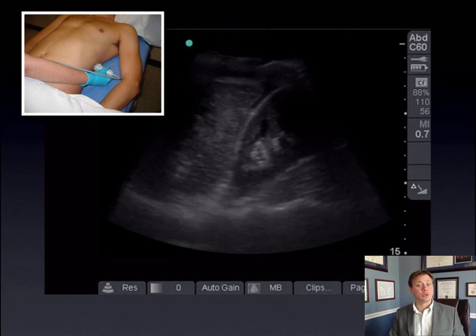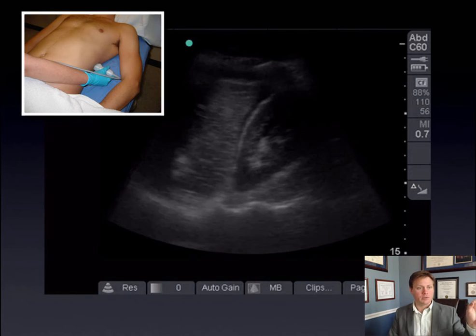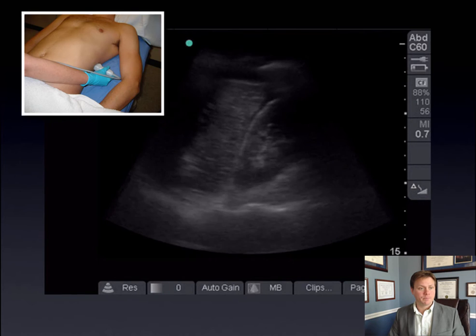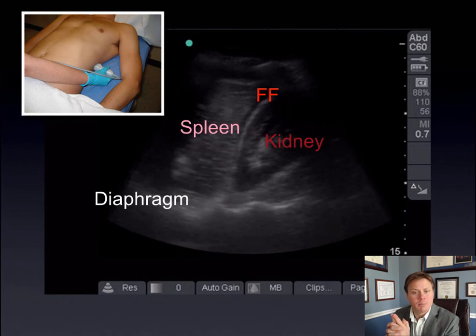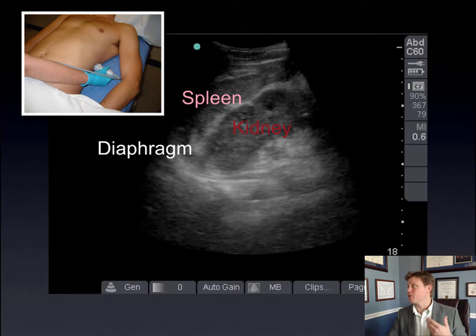All right, let's turn our attention now to the left upper quadrant here. You can see there's a fairly similar appearance of a black stripe of free fluid between the spleen and the kidney. But what about this example here in the next slide? So here I can kind of make out the kidney, I can make out the spleen, but do we see any free fluid? Well, this one's a lot harder to tell. What if I were to tell you that this is a positive FAST examination, but rather than free anechoic fluid, we've actually got some free fluid that's been sitting for a little bit and starting to develop clot.